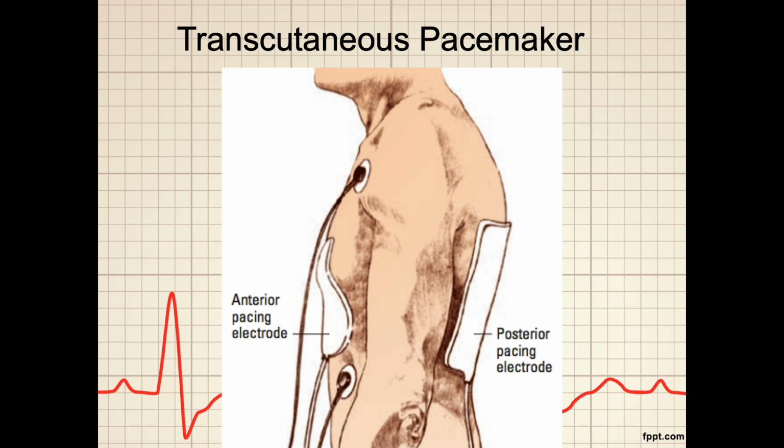You should also know that although these are very versatile pads, they cannot be used as both a pacemaker impulse generator and a sensor. These devices, therefore, will require you to have a separate set of electrodes, that is, ECG leads, available to talk to the temporary external pacemaking generator.